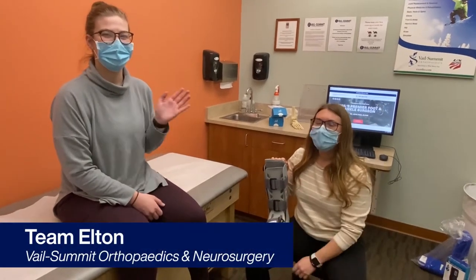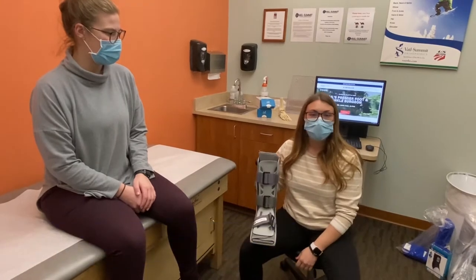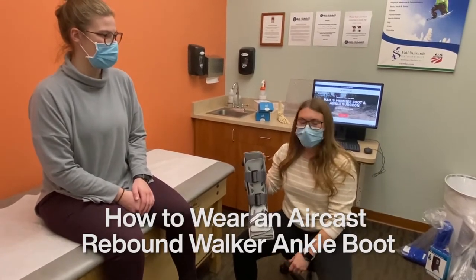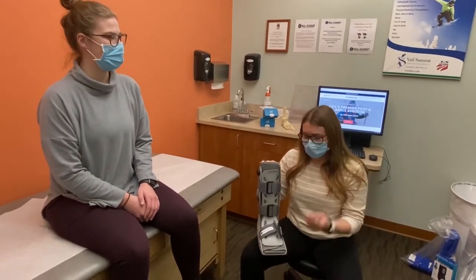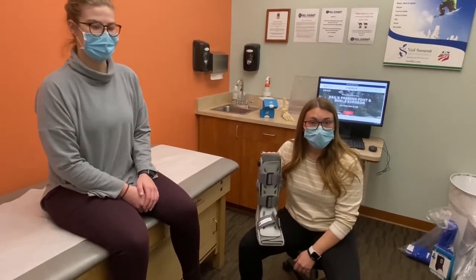Hi, I'm Amanda. This is Abby. We're members of Team Elton. We're going to give you a little tutorial on how to use your rebound walker. This device is typically prescribed for patients if they have issues weight-bearing post-injury, so usually an ankle sprain, fracture, and sometimes post-operatively with any type of ankle surgeries.